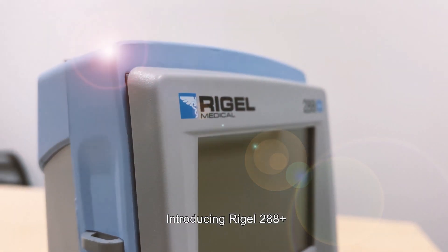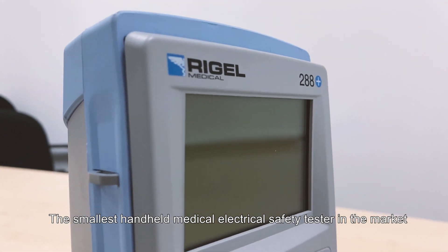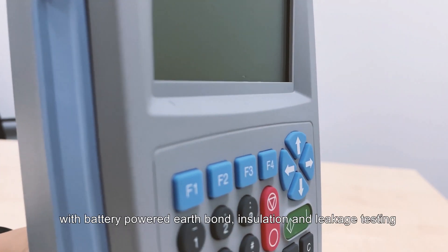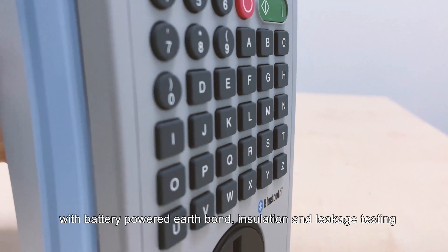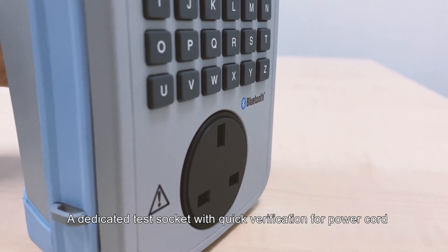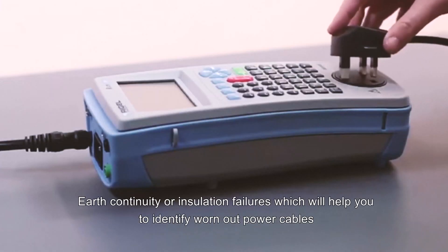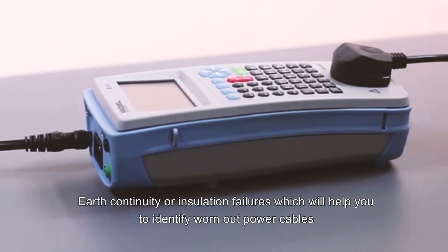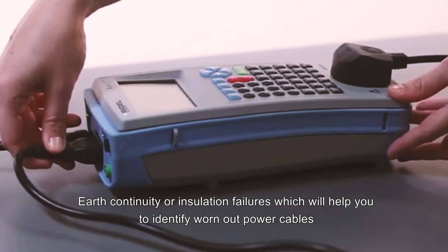Introducing the Rigel 288 Plus — the smallest handheld medical electrical safety tester in the market, with battery powered earth bond, insulation, and leakage testing. It features a dedicated test socket with quick verification for power cord, earth continuity, or insulation failures, which will help you identify worn out power cables.